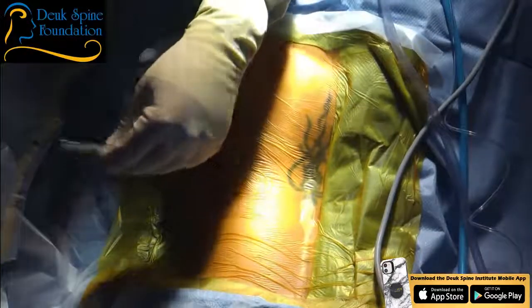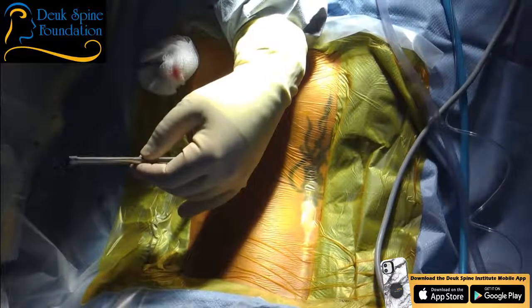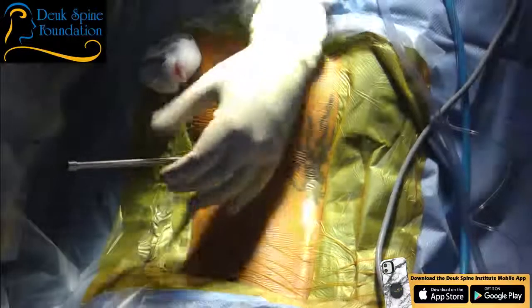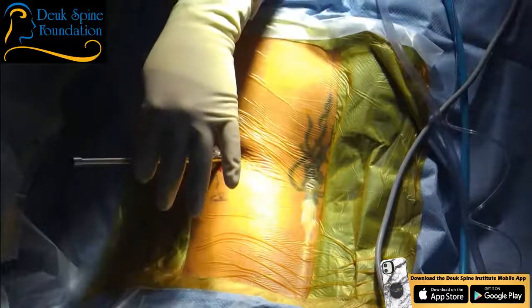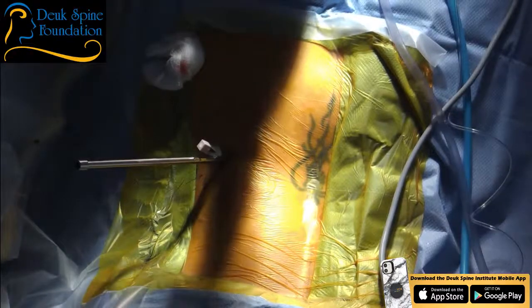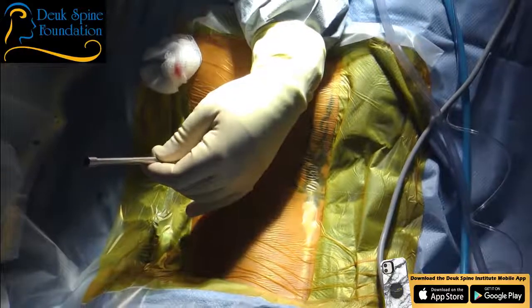Laminectomy: the surgeon removes bone and ligaments. Microdiscectomy: the surgeon removes bone, joints, and ligaments. Fusion: the surgeon removes bone, joint, ligaments, and the disc. Artificial disc: the surgeon removes the disc and ligaments. So this is the least invasive of all spine surgery.